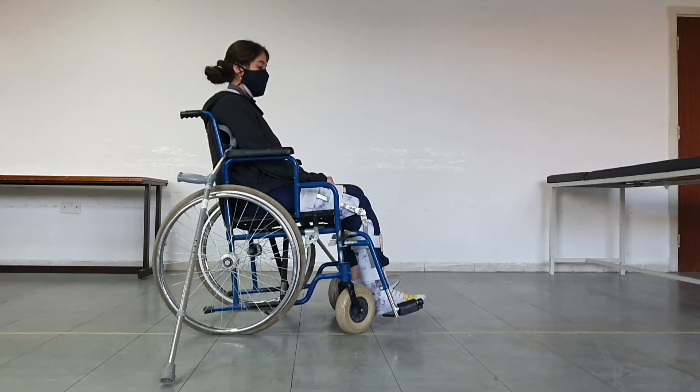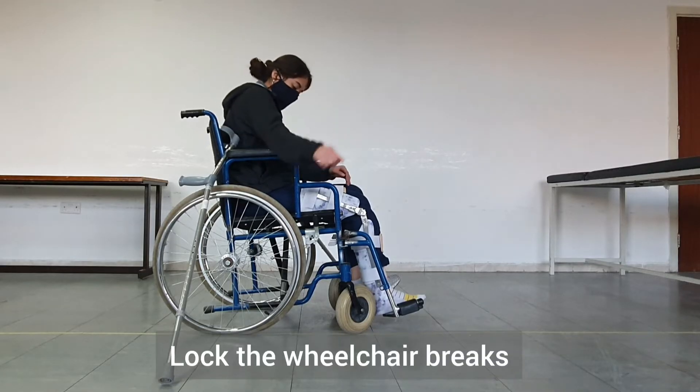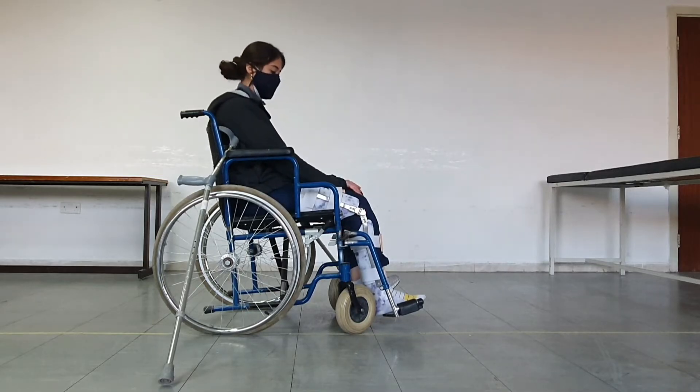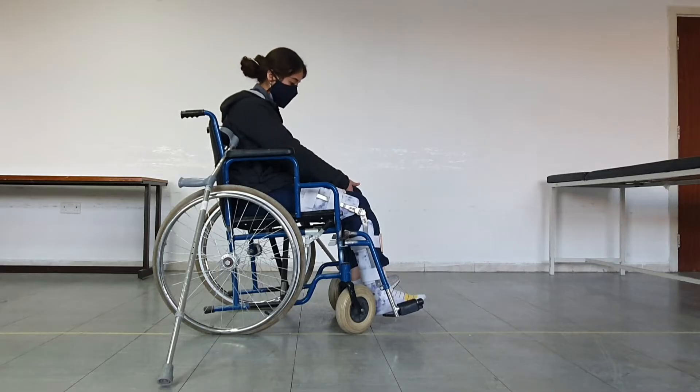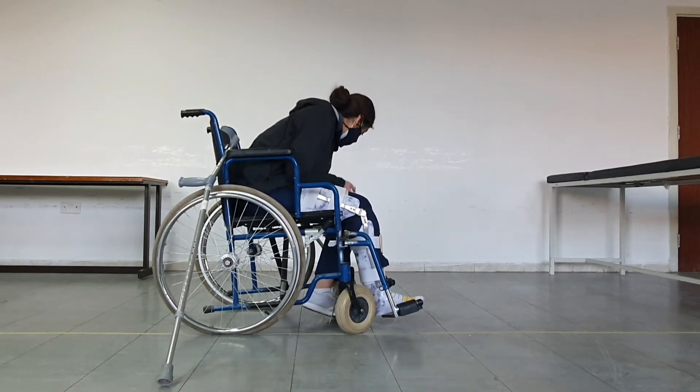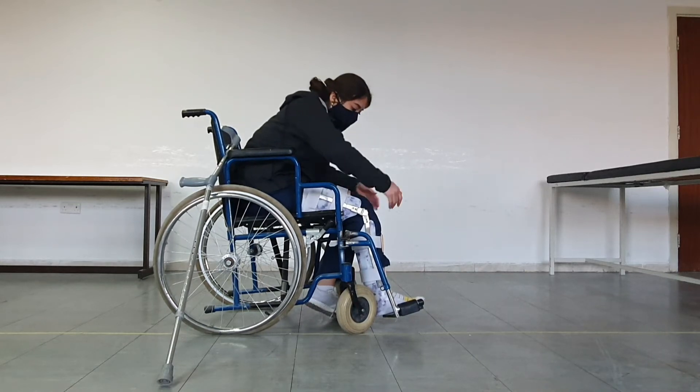Now, to move to standing position, first we will start by locking the wheelchair brakes. Next, we will move the patient's legs off the leg rests — the patient will lift the leg, put it on the floor, and move away the leg rests on both sides.